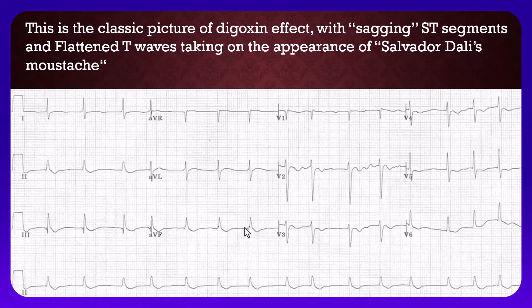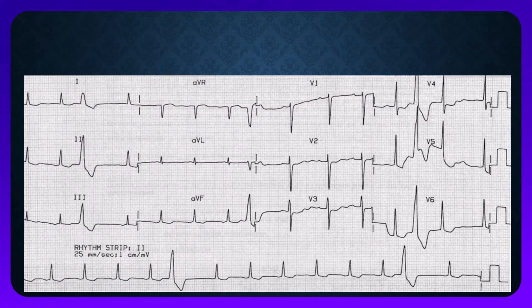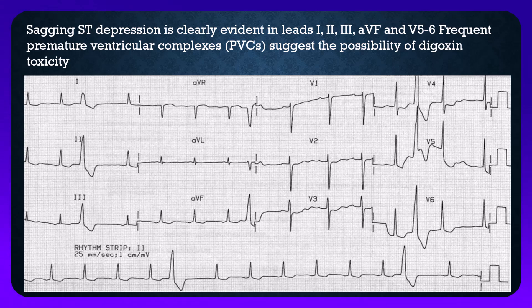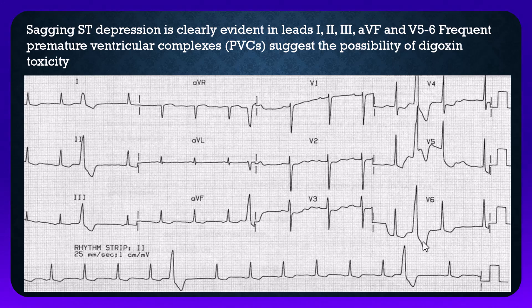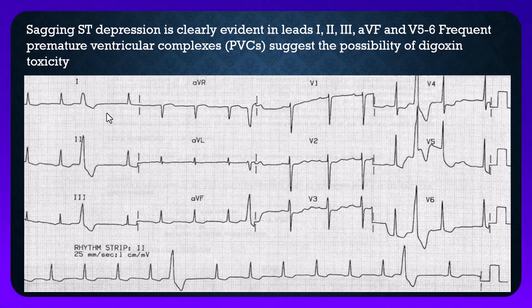In another ECG, the sagging ST depression is clearly evident in leads I, II, III, and aVF, V5, and V6. It is also associated with premature ventricular complexes, suggesting the possibility of digoxin toxicity. If premature ventricular or atrial beats occur together with the signs of digoxin present on ECG, this may be taken as digoxin toxicity. Here in leads I, II, III, and aVF, and V5, V6, you can see ST segment depression and T wave flattening with multiple premature ventricular ectopic beats.